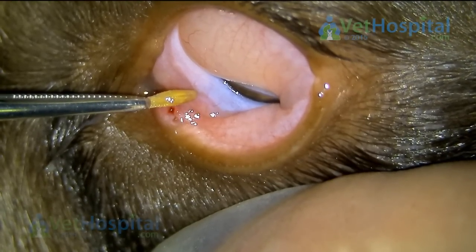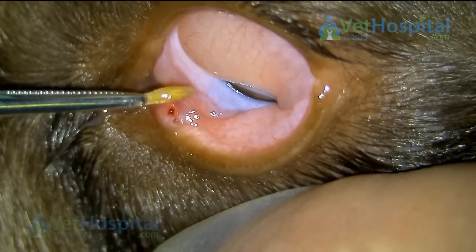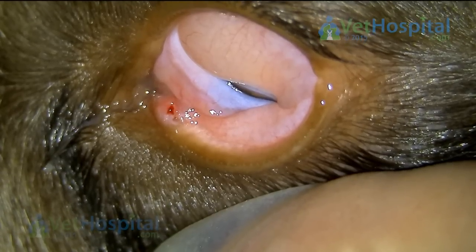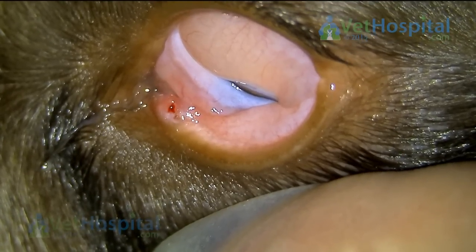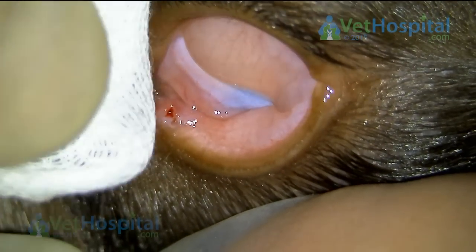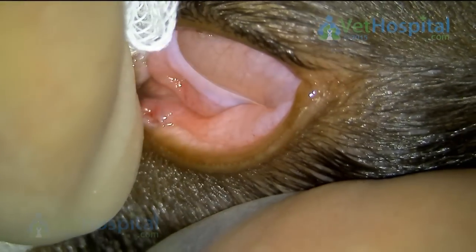Owners sometimes wonder why we suggest using sedation and local anaesthetic to examine red eyes or eyes that appear to be sore. This video illustrates the need to examine the eye properly and to make sure we don't miss horrible little foreign bodies like this.